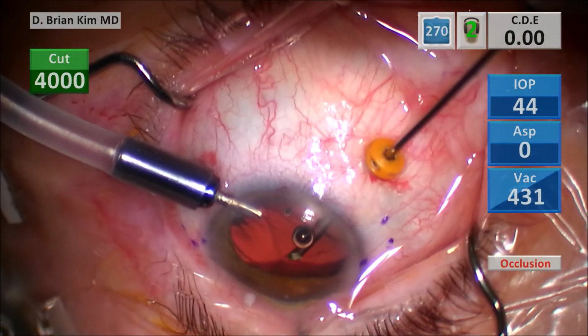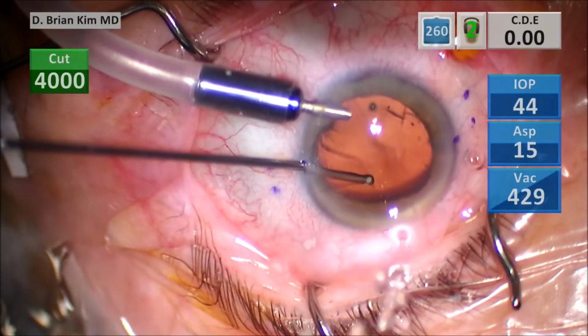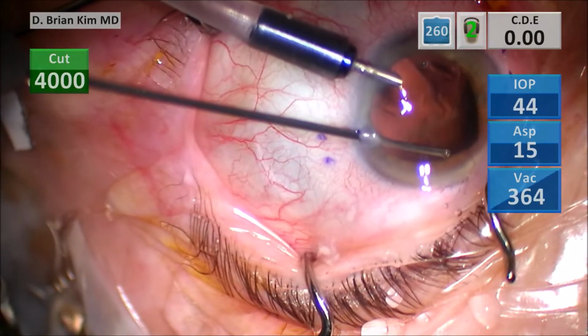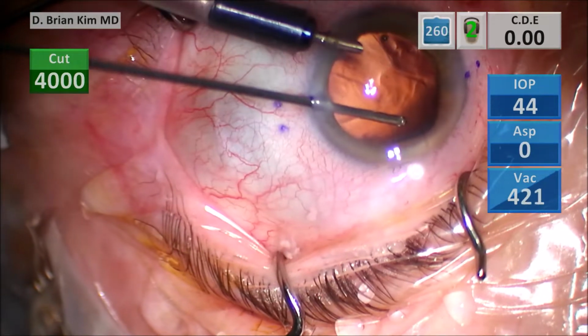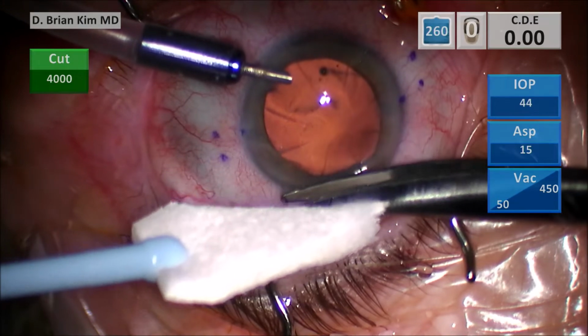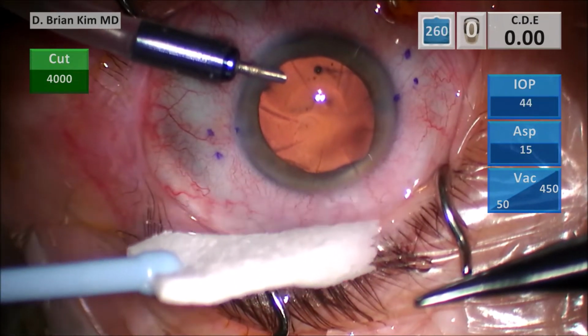I'm starting to do some vitrectomy through the trocar, but as you can tell, this is a very awkward position to do vitrectomy. I did some vitrectomy through the trocar, and then now I'm going through the temporal paracentesis incision, doing some more vitrectomy. But the truth is, there's still some vitreous there. You see, I use a Weck-Cel to check, and there's just a little bit, not a whole lot, just a little bit of vitreous.